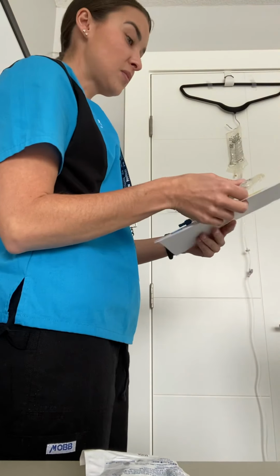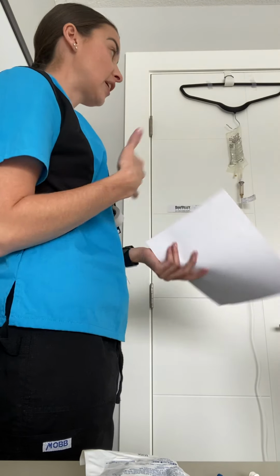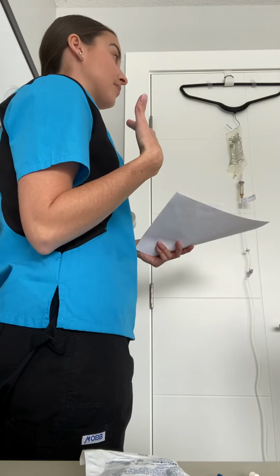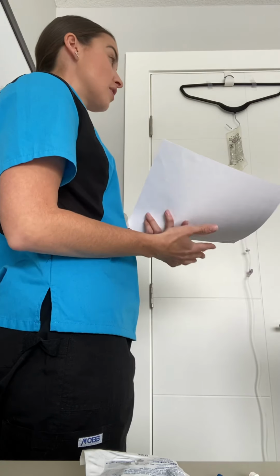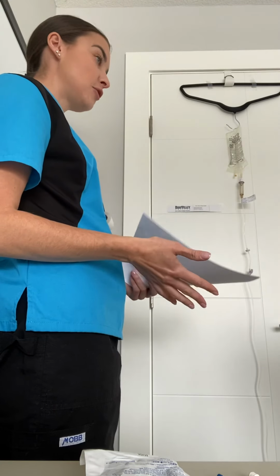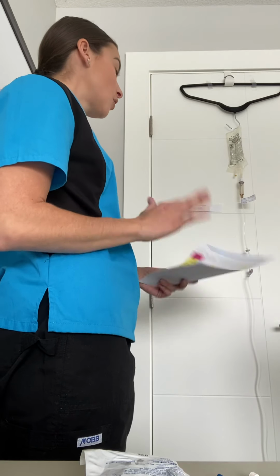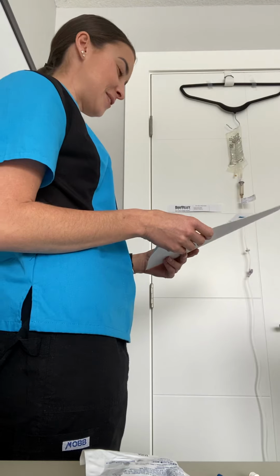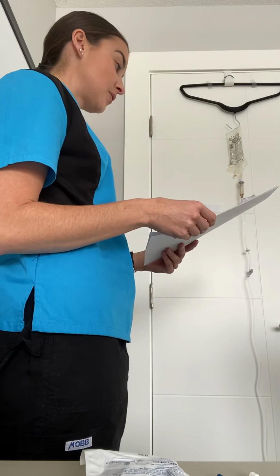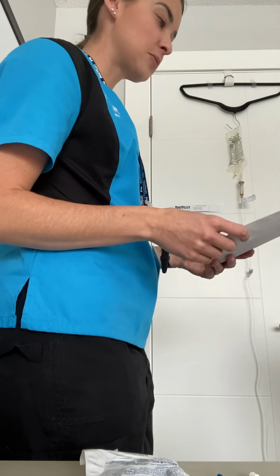I also just wanted to ask about your IV site now as well. With your IV site, we are looking for any signs of infection. So erythema, which is redness, edema, kind of swelling, bruising, which is ecchymosis, or any kind of itching, anything like that. I saw that you have no allergies. Do you have any food allergies even, or allergies to medications that we're unaware about? No? Okay, no allergies. Lucky you. We're not all that lucky. Perfect. Okay, so I'm glad that your IV site is reacting well to all of the medications you're getting, especially when you're going through chemo. We want to make you as comfortable as possible.